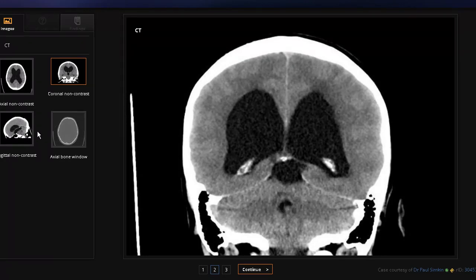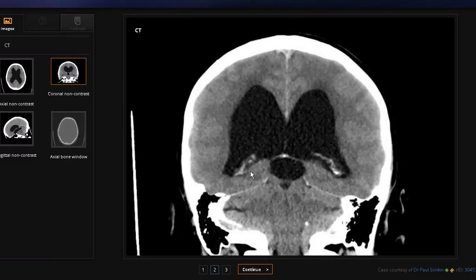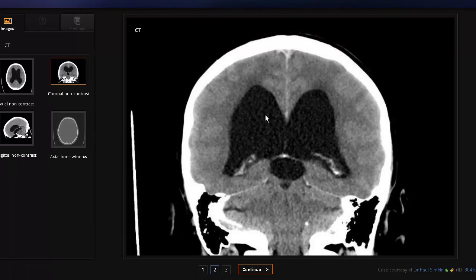This is the same CT scan in coronal section. It is only the lateral and the third ventricles which are dilated. Here is a bit of the projections of the choroid plexus. Remember that all three ventricles have choroid plexus — in the lateral, in the third, and in the fourth. They are blood vessels pushing through the pia mater and the ependyma, which is the inner layer of the ventricles, and it is through them that CSF is produced.